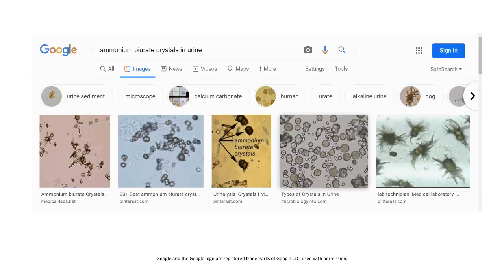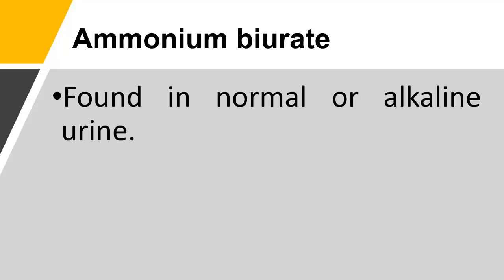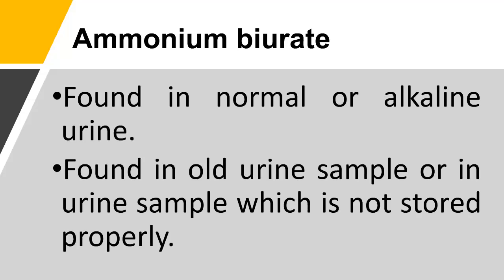Ammonium biurate crystals in urine are found in normal or alkaline urine. They are also found in old urine samples or in urine samples that are not stored properly.